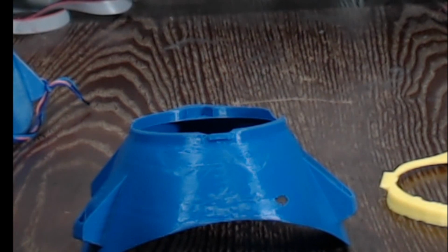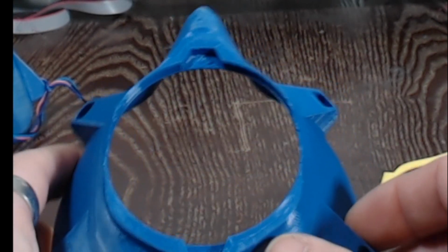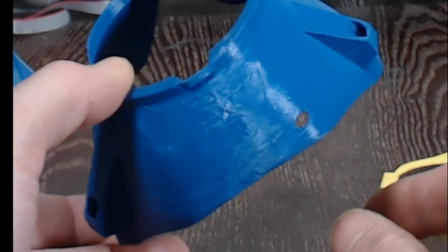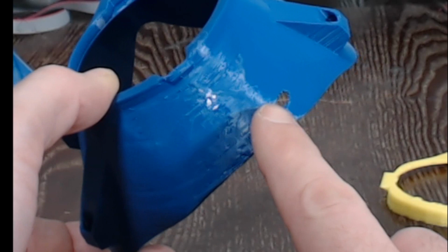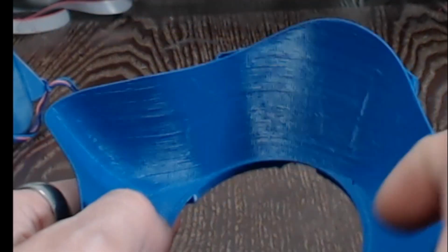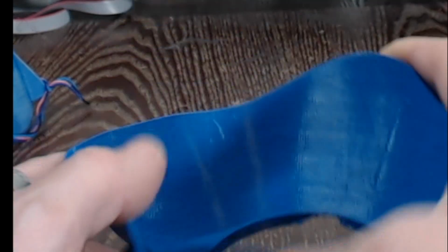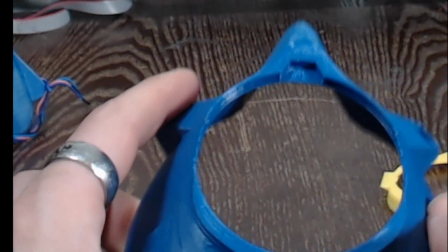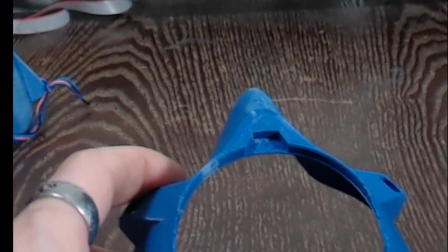Now, in order to get the settings right to make the parts fit properly, I did have to adjust some settings in Cura, such as my horizontal expansion. And this was my first attempt where the horizontal expansion was adjusted too much, and that left a couple of holes in the model. And as you can see, the mask is quite a bit thinner and flimsier than I intended, and the pieces don't quite fit as well.